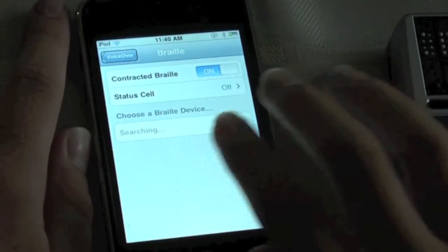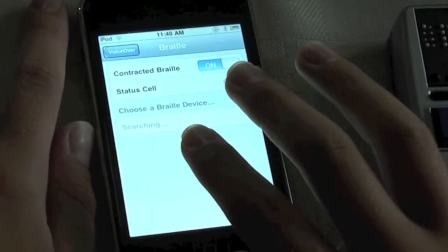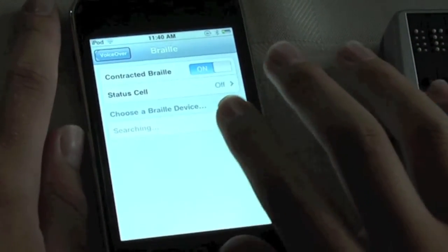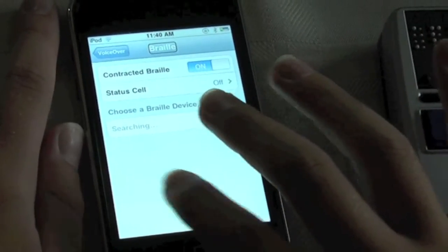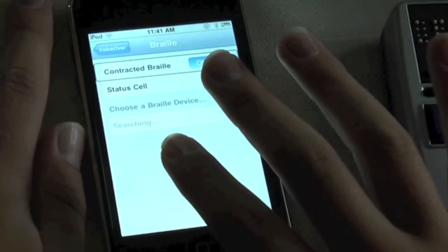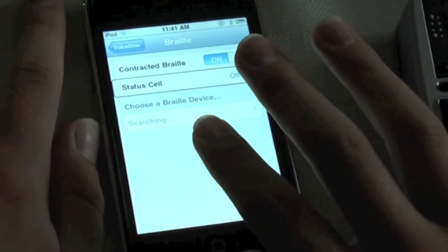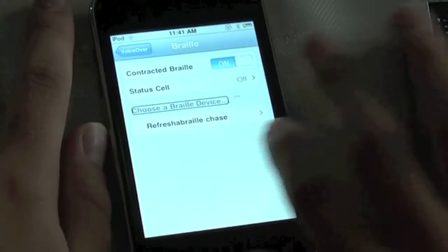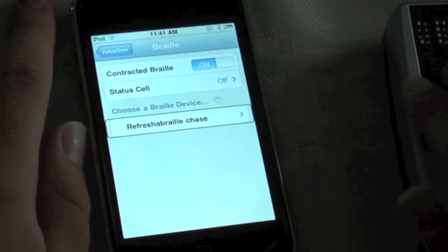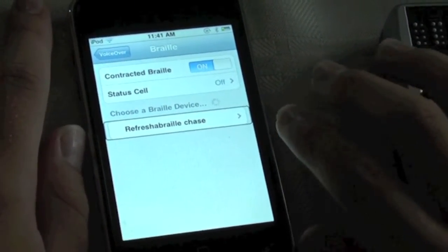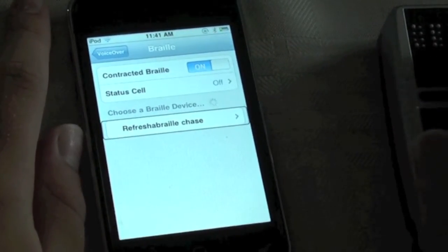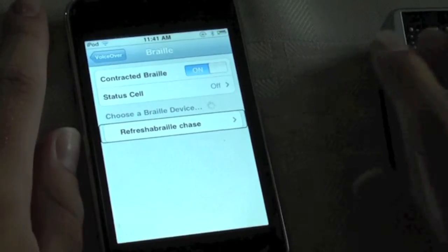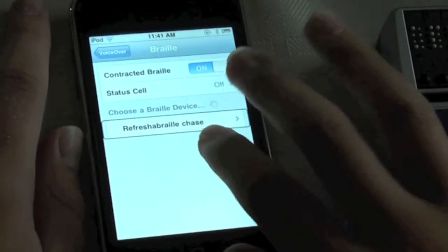And now we'll have some Braille settings as well as the displays that are in range of the iPod. I see Contracted Braille is on, which shows grade 2 Braille. Status cell is off. Now the iPod searched for my Refresher Braille which is called Refresher Braille Chase as I've named my display Chase. And it has already found it. What we need to do to pair it is to double tap.